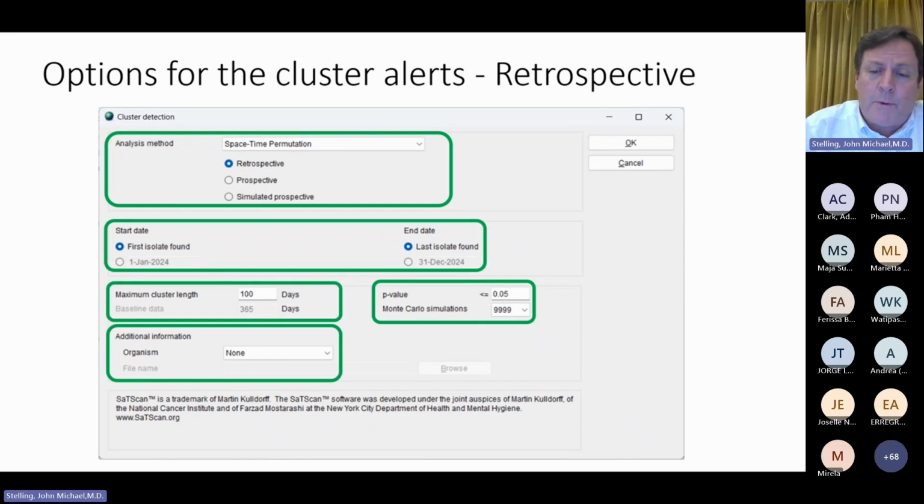And the analysis will go slower. So normally I don't change this, 9999 is fine. However, if you do have a very slow computer, you might want to change this to 999. Doesn't change anything, it's just is it better to do an experiment 100 times or 1,000 times? Well, either way, the experiment is fine. It will be slower to do it 1,000 times, but you'll also get a more precise answer.